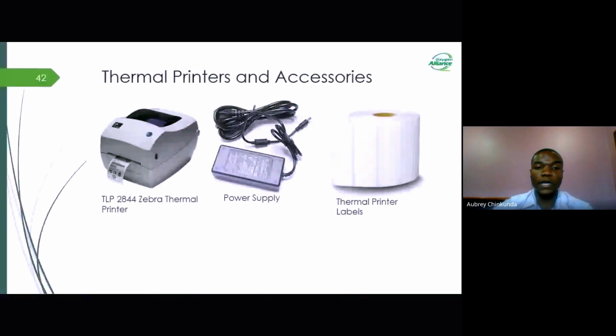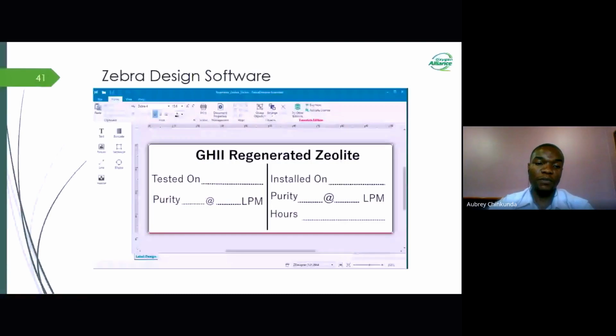And this software can be downloaded. The link will be pasted in the chat. You just go there and download the software and install it on your laptop or PC, or whatever machine that you're using. And it has multiple options. You can include a barcode on your equipment sticker. You can design various shapes and also include various texts. There's also an option where you can print the sticker once it's designed.